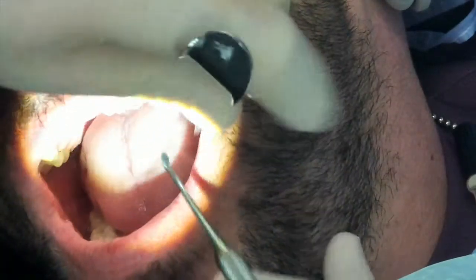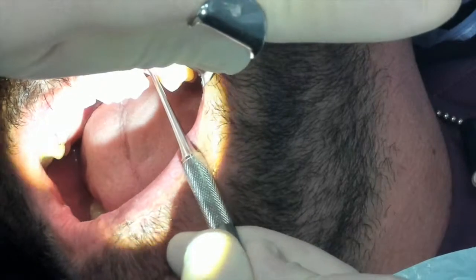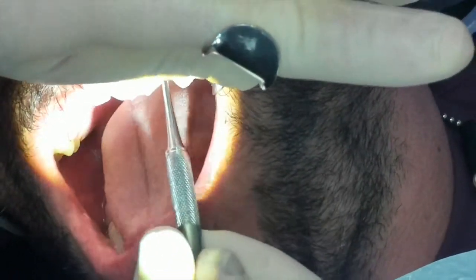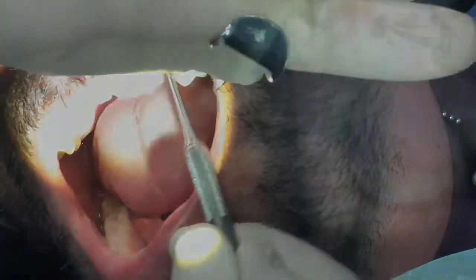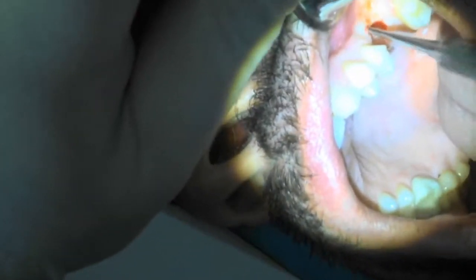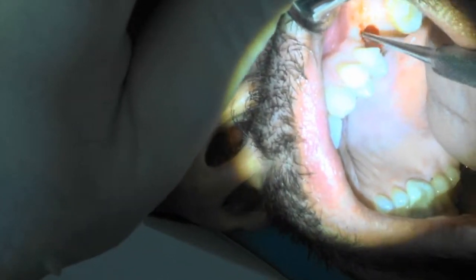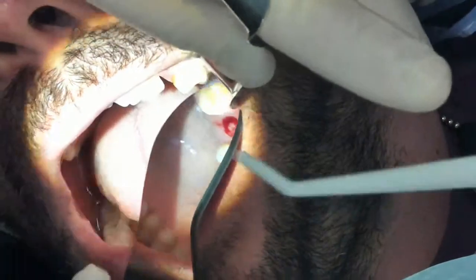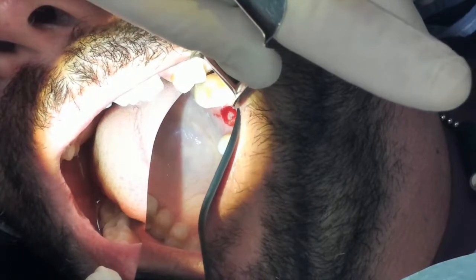My emergence profile. Ina, if you can grab that mirror again. And what we're going to do now is what I was talking about. From the internal site that I just created, I'm going to plump out this tissue. So I've created this almost pouch. In here, the implant most likely will hold that tissue out. If not, I'll put some graft in. It's no problem. But now I've got my emergence site for my implant where I'm ready to go.